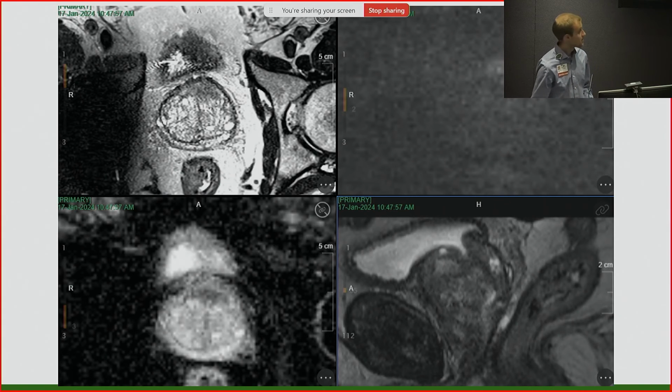So I would not have routinely biopsied an inch or two through his prostate up to there in the office. So, he could have had a couple biopsies through the years, rising PSAs, and he may not have found all of that. Now, he may have found a little bit of disease elsewhere, but it does change a little bit what you know based on having a larger burden of disease in the anterior gland up there.